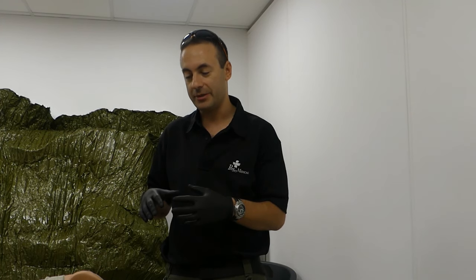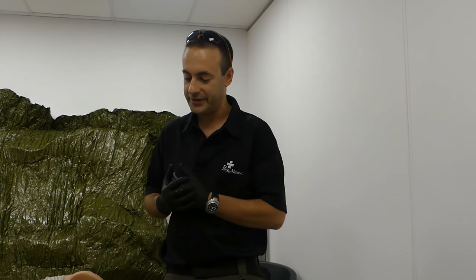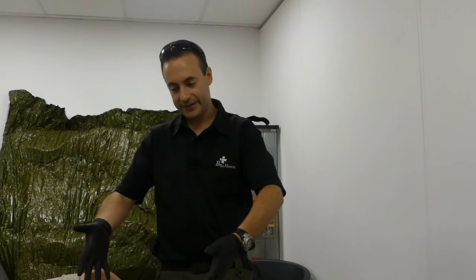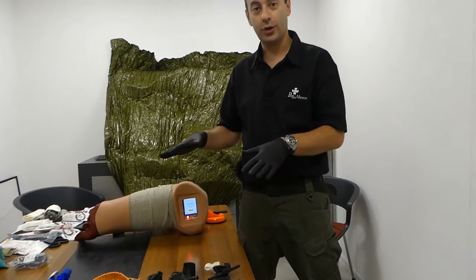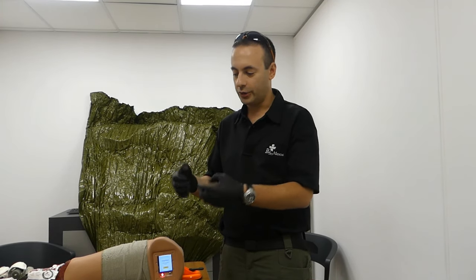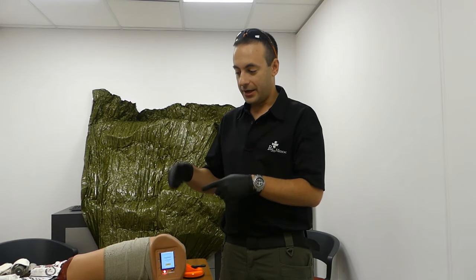Hey guys, I'm Eddie from Persis Medical. We are the manufacturer of the Israeli bandage, and today we are doing some reviews about the common tourniquets — the tactical tourniquets on the market. Thank you IDF Gear Review and NCTM, the National Center of Tactical Medicine, for being here. Let's start by showing some tools we have in the market. It's important to mention the CoTCCC-approved tourniquets like the SAM XT, which we don't have here, and some others that are approved.